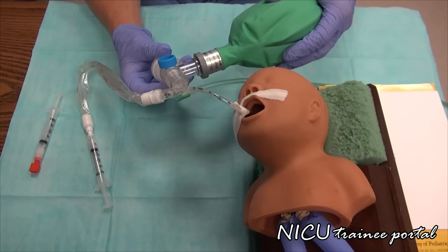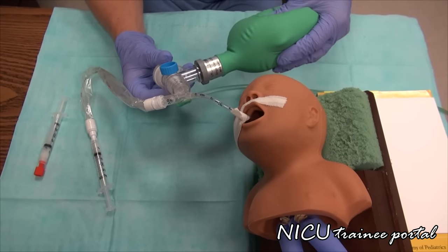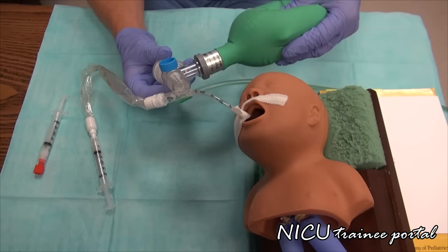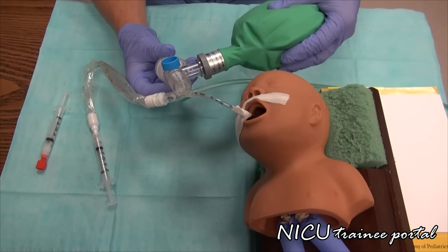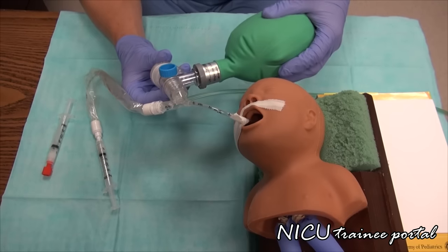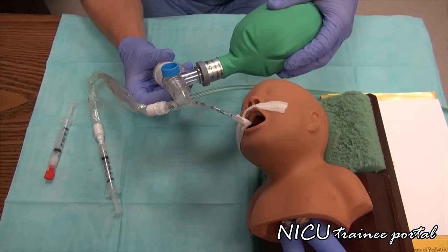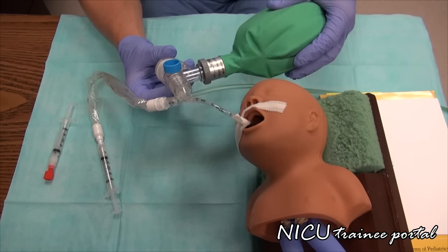Also, after intubation, listen for bilateral breath sounds, making sure the tube is in proper placement. Prior to administration, you might bag at around 40 to 60 breaths a minute, or bag at a normal rate prior to administration of the surfactant. After, you might bag at a slightly faster pace.